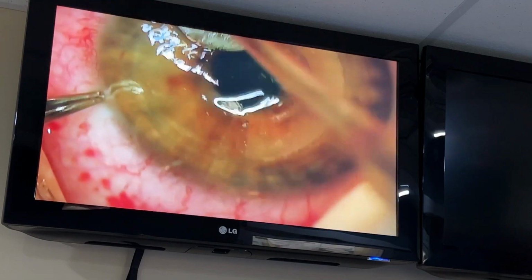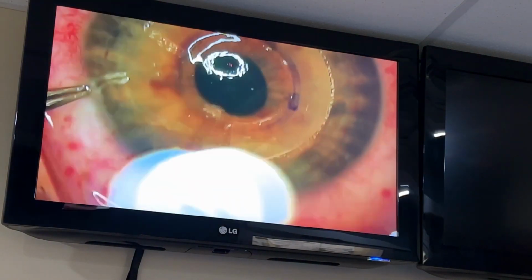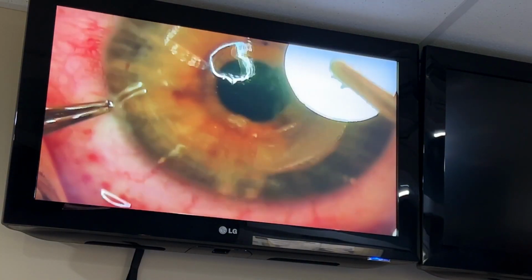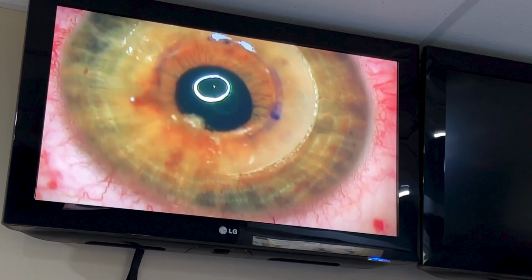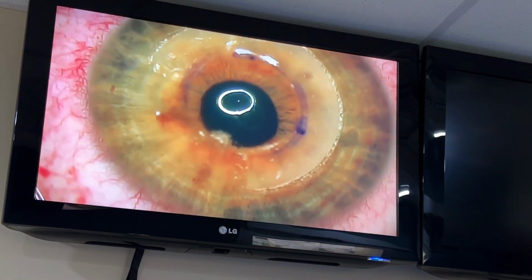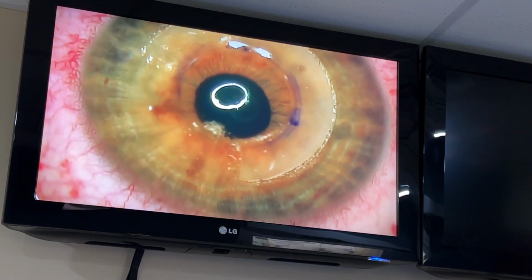And by the way, I've moved as well to pre-marking. I skipped this step, but I pre-mark these patients at the slit lamp as I'm giving them their sedative or whatever, with that edge 1 and edge 2 angle. That's helpful because they're upright. I'm not worried about cyclotorsion. And then I know exactly where this inlay should sit. And if it's not all the way to the edge 2 angle, then I know that I haven't stretched it enough, right? So that's my easy sign that I've got a stretch, or I may have some stria. Just like when you're doing LASIK, you may have some gutter issues from one side to another.